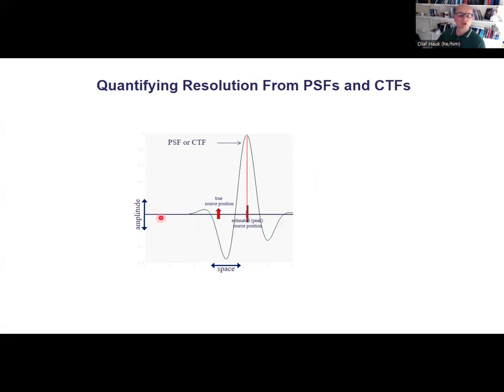The two most common measures that I think have been used in the literature to compare methods or evaluate spatial resolution are the localization error and spatial extent. So imagine you have a point spread or crosstalk function like this here in just one dimension. It's usually not doing us the favor of being nicely Gaussian, so the average or standard deviation usually don't have the same interpretation as with a Gaussian function. It's usually a bit more annoying. So you have a peak somewhere which is different from the true source position. That would be localization error. And it also has a spatial extent. It has side lobes. It goes up and down, positive, negative. But you also want to find a measure for the spatial dispersion. Just keep in mind that it might not be exactly like a standard deviation for a Gaussian function, but the formula is basically the spatial deviation in space. So that's what we call spatial dispersion here.